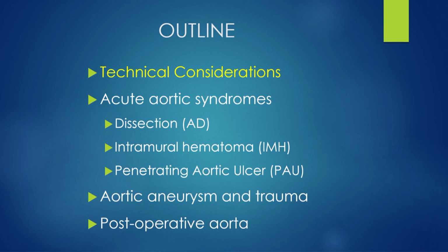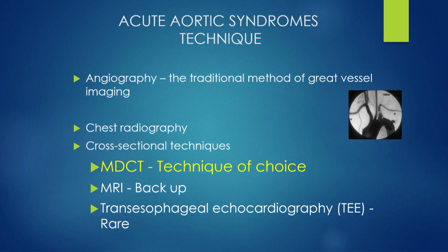So I'm just going to talk a little bit about some technical things, and then we'll go into the classic acute aortic syndromes, and then talk about some of the other variants on the theme. And that will be a pretty good discussion. Okay, so let's talk about technique or technical possibilities.